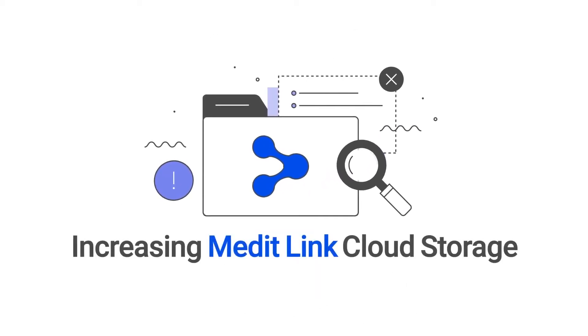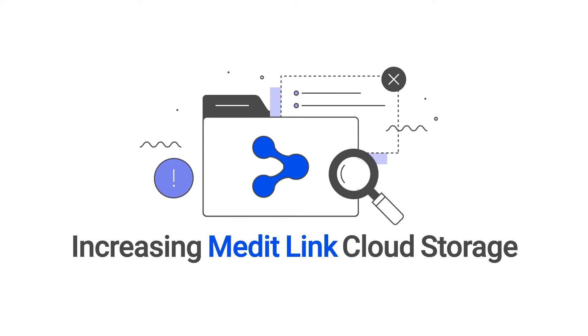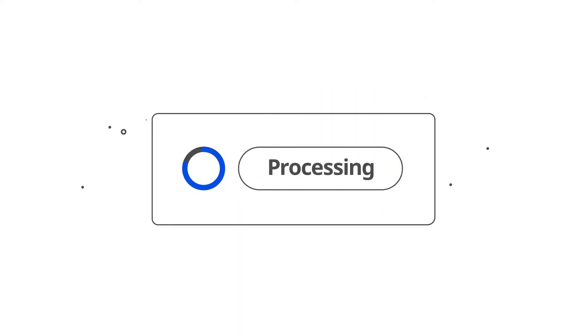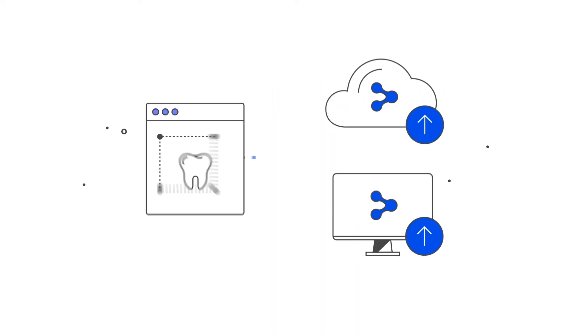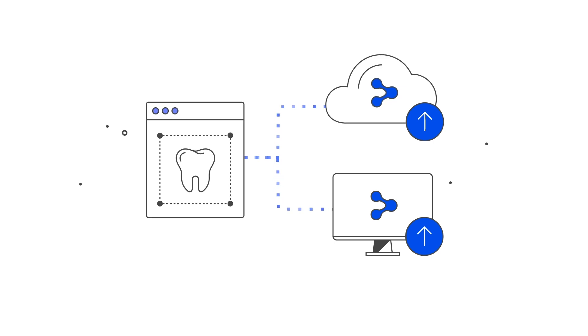In this video, we will explain how to increase your storage space in Medit Link. After processing, your scan data is saved both to the local PC and the cloud.